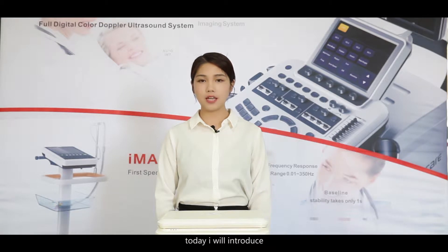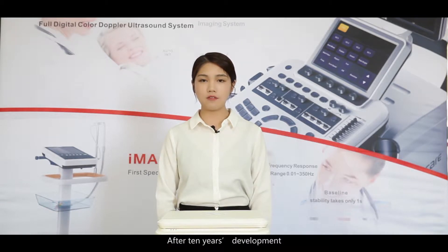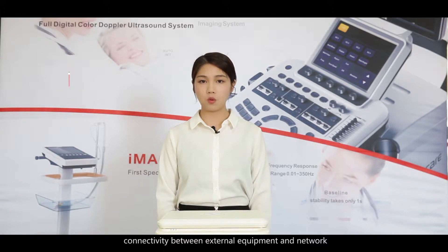Hello everyone, today I will introduce the ZoneCare iMac series ECG machine for you. After 10 years of development, the ZoneCare iMac series ECG machine has reached a world-class level in reliability and stability, data measurement accuracy, system response rapidity, and connectivity between external equipment and network, parallel man-machine interaction, and aesthetic design.